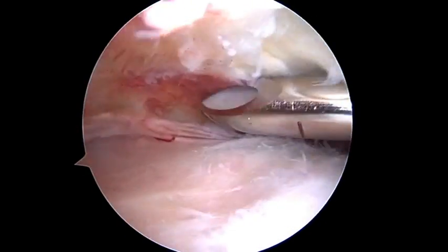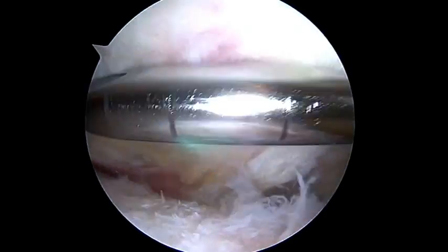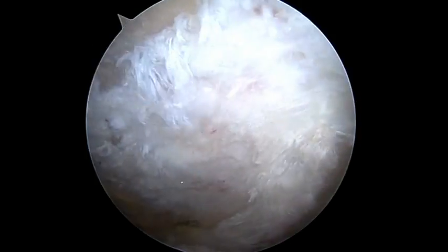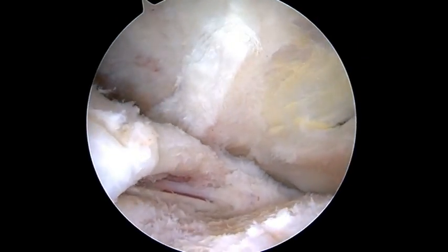Now I'm in the subacromial space, cleanly and quickly removing the subacromial bursa and the undersurface tissue from the acromion. So really, with this one instrument, I've been able to do this all rather rapidly and prepared for my rotator cuff repair.